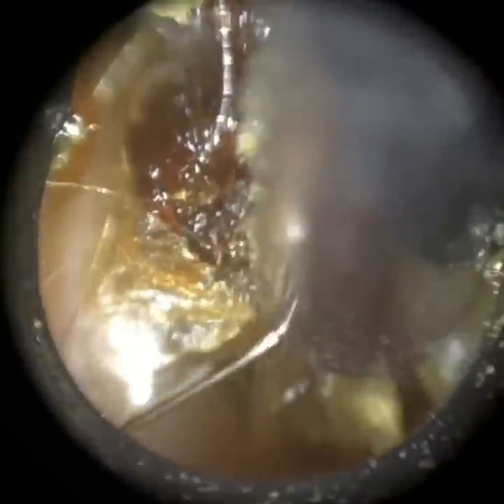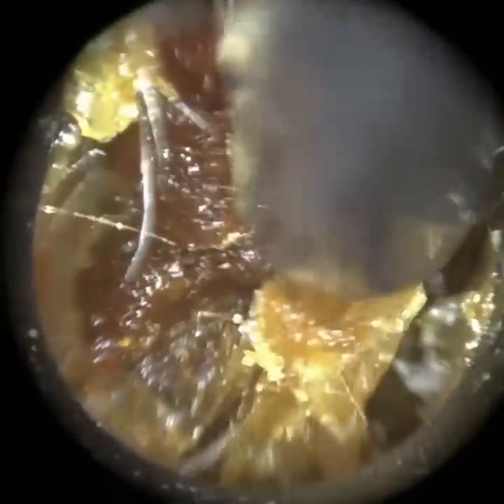Then we've got a larger speculae, which is a 5mm internal diameter, and then we've got the extra large one for surgically operated ears — for example, a mastoid cavity — which is a 5.75mm speculae.